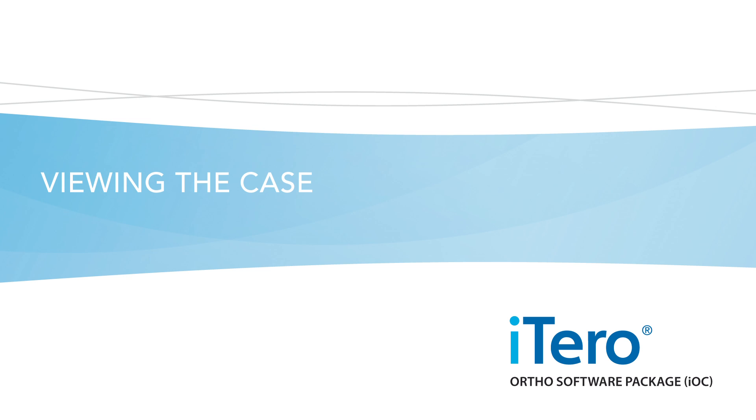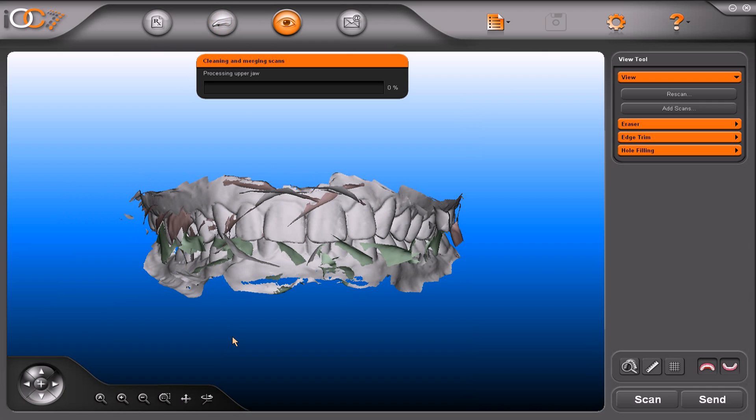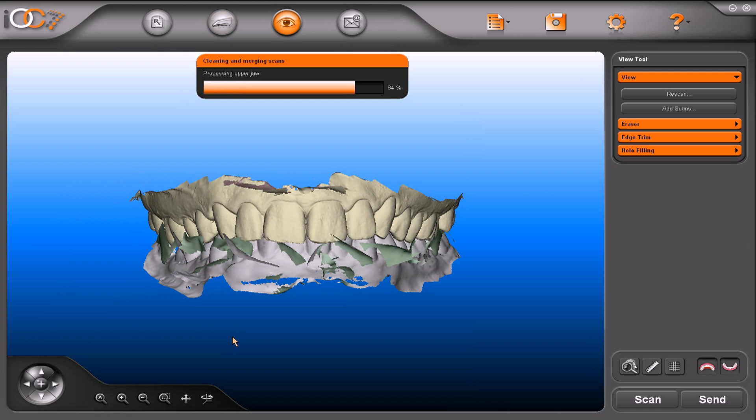Viewing the case. Once all segments have been scanned, you will see a preview image with a lot of the soft tissues that were captured in the process — basically the lips and cheek. The white model indicates a preview surface. The system is processing the data and will remove the soft tissues when done. The surface will turn yellow, showing a sharper, high resolution model. Both jaws have now been completed and processed.